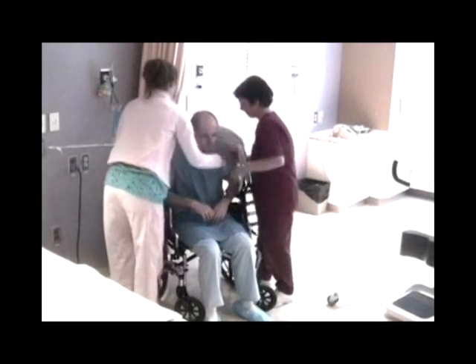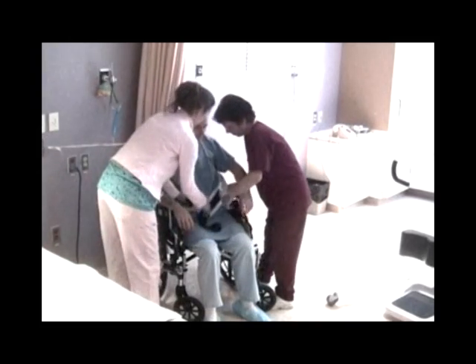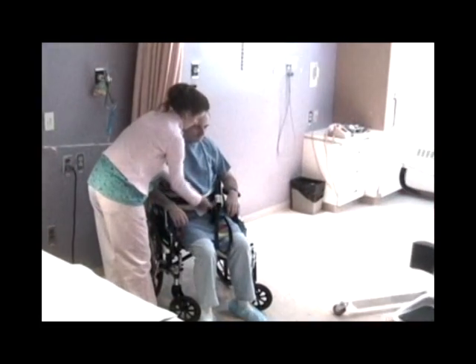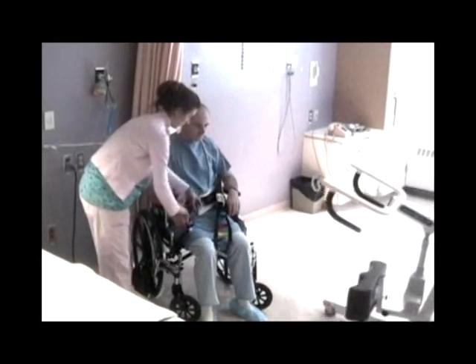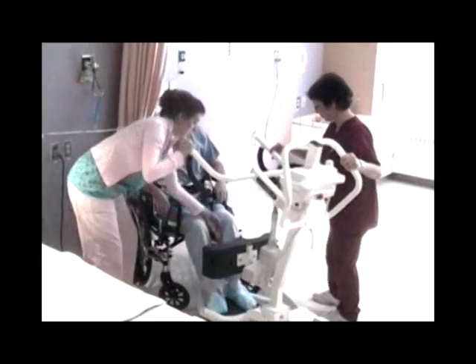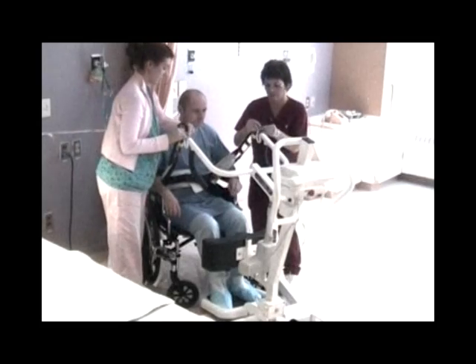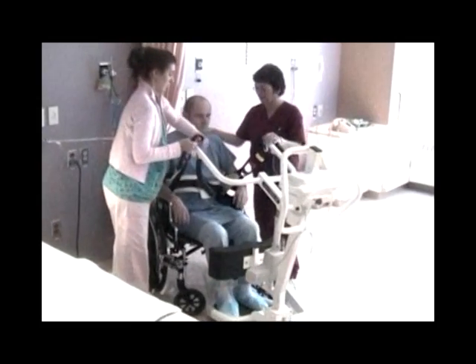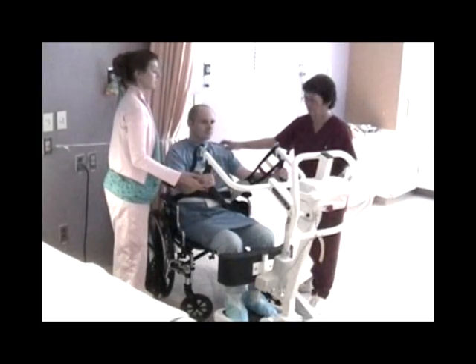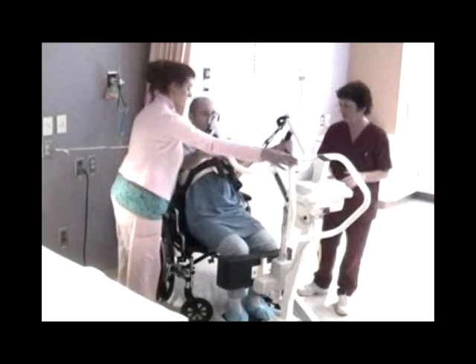Procedure for the SARA lift. Instruct, or assist, the patient to lean forward to apply the harness. Position the lift in front of the patient and instruct them to place their feet on the footplate. Attach the harness loops to the boom and instruct the patient to grasp the handles and to lean back into the harness. One caregiver will operate the hand control, and the second caregiver will guide the patient as they are being lifted to the bed by holding on to the back of the harness.